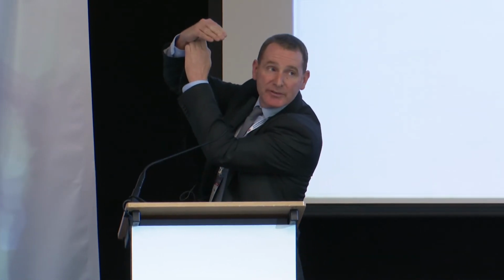No, it's a problem because in ruptures, due to the aneurysm, in many cases, you will go up against the wall. It will be hard. At times, you will succeed, but at times, and we have several cases, and two done in the ER, you will go up and you will go into the aneurysm. So we would prefer imaging, and it takes time to go up. So it's an issue. It's not that easy. Trauma might be easier, the autostrada way up.